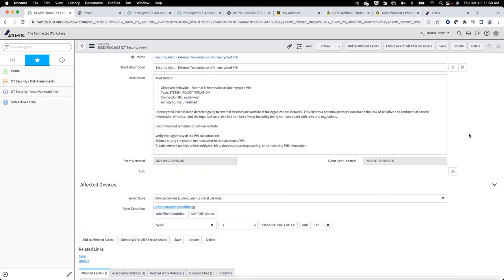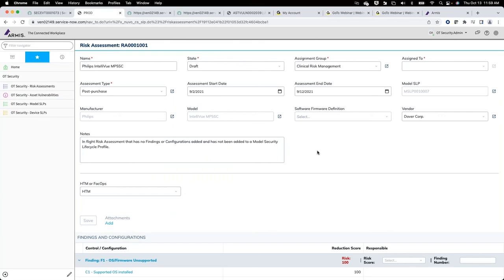Because understand, we focus quite a bit on CVEs. That's just one component, one thing to focus on to establish risk. What about FDA recalls? What about out-of-date operating systems? We touched on it quickly around putting controls, right? They're preventive controls. You're not going to prevent an outdated system. The only way to deal with it is to actually replace it, but because of other factors, cost, budget, that may not be an option. Then you have to explore mitigating controls. Do I put a firewall? Do I limit its use? What else can they do to mitigate that risk? So there are other options.